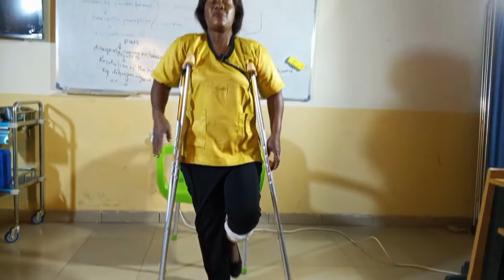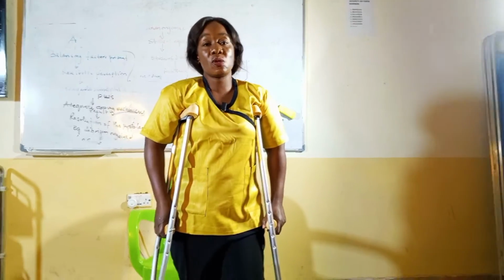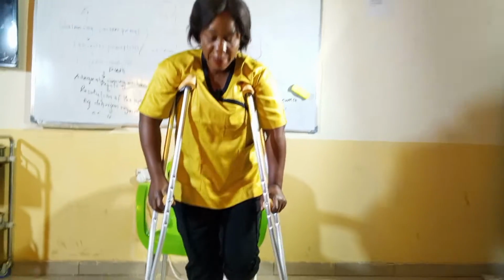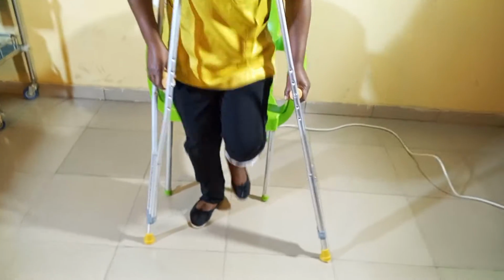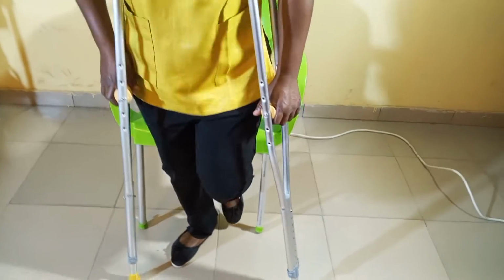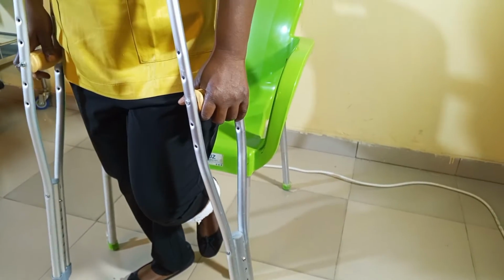Now, from standing to sitting, right? While the patient wants to sit after walking, you tell the patient also to bring yourself closer. Make sure that the back of your foot is touching the chair, right? The back of it, like the way the back of my legs are touching the chair, right?